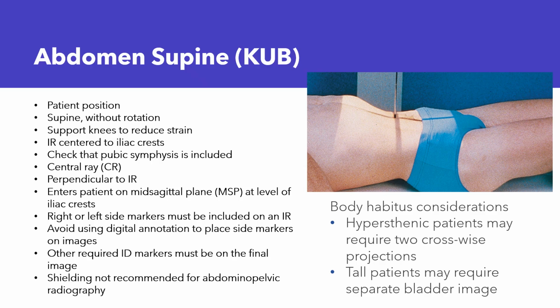Now, your older folks and some of your younger folks, laying down on a table is not going to be comfortable. If your patient's uncomfortable, they're going to move and shift so that they do get comfortable. That usually means rotation of the part. So we make them comfortable.